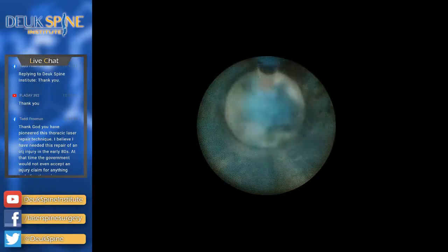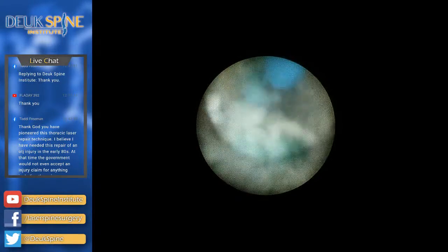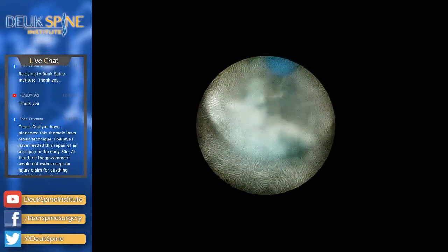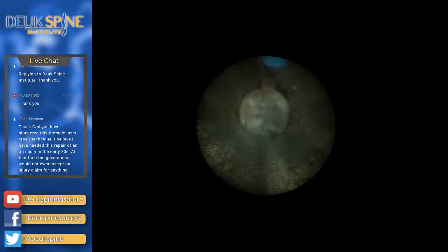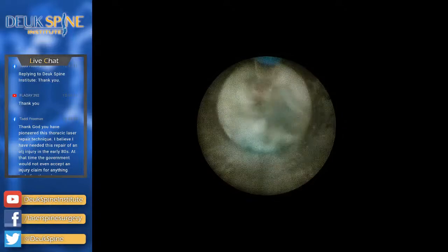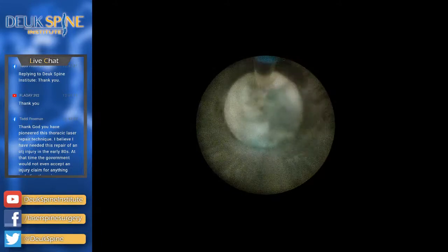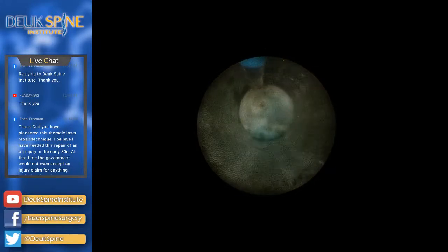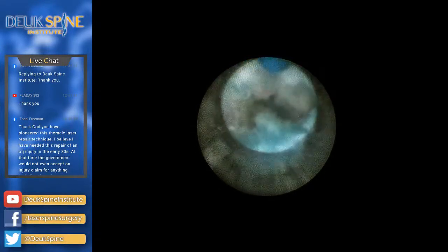All right. Oh, there's a piece of herniation right there. Beautiful. Try to zap it away. See that, folks? I put a little pressure and it squeezed into the cavity that we're using to remove the herniations. So we're doing a good job. Everything's going well. A lot of scar tissue. This injury is some age old. I don't know how old his injury is, to be honest with you. I don't know when this injury occurred.